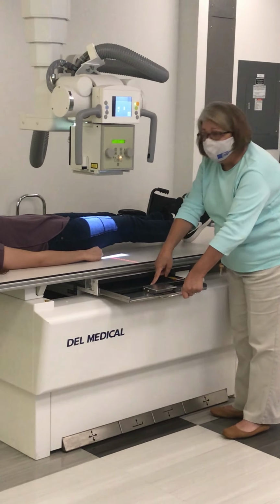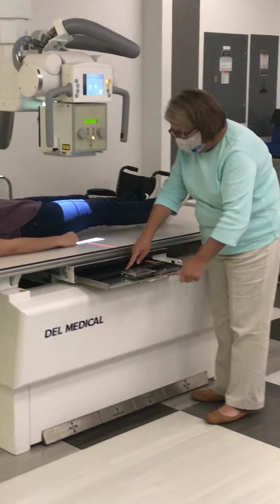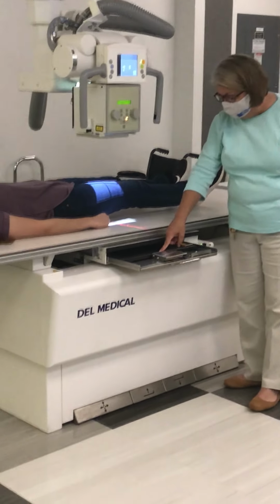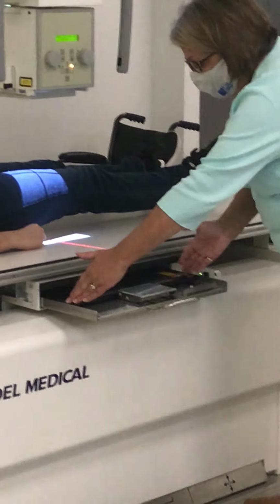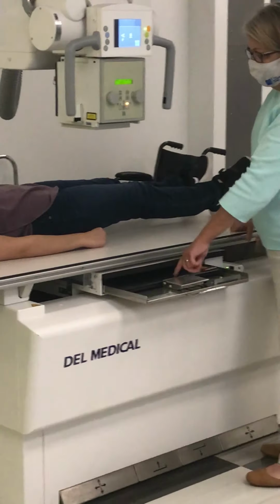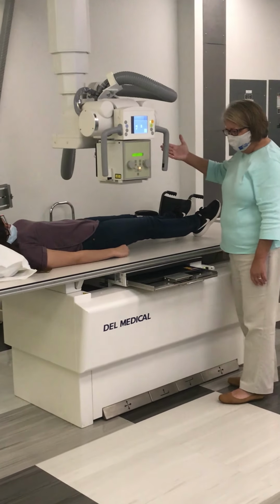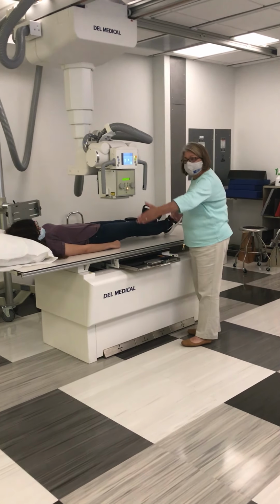There's a little red triangle on this image receptor, and I'm lining up the red laser to that little red triangle. Lengthwise, that's the center of the image receptor. So now I know I'm centered to my image receptor transversely, across, and up and down.